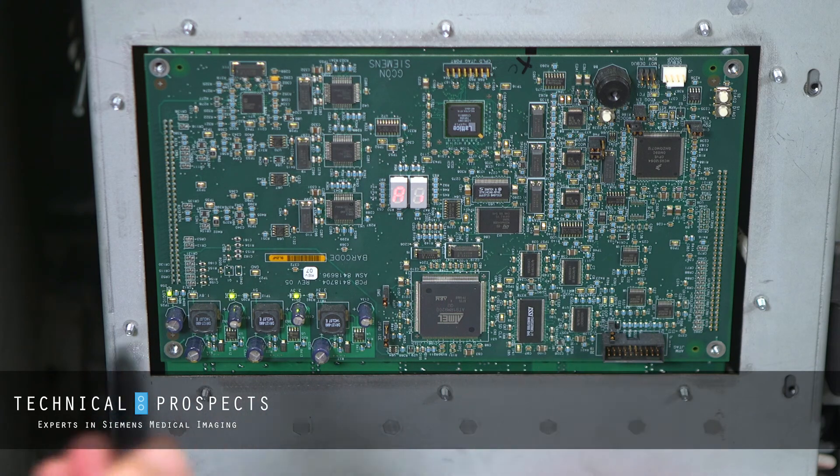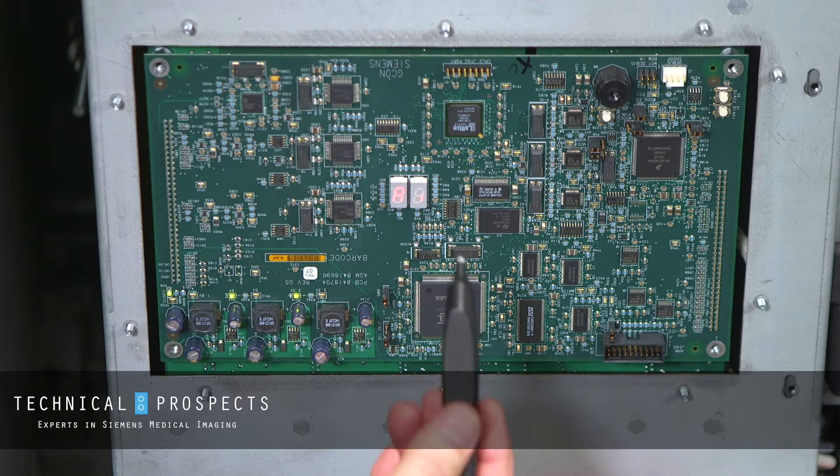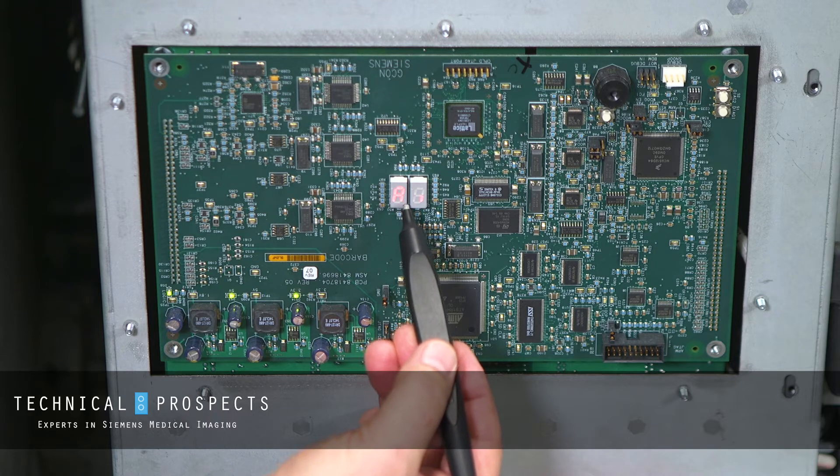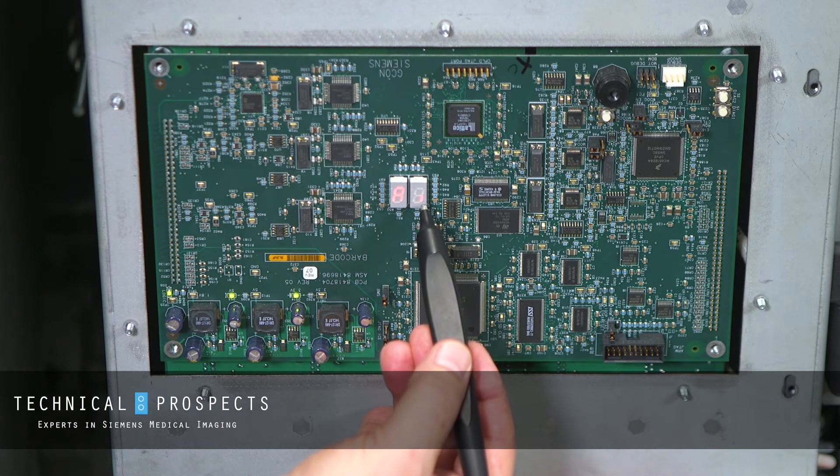This is the GCON board. It's located on the left side of the gantry once you remove the outside cover. On this board, in a normal status, the seven-segment display shows an A and a 1 — or an AI — whichever way you like to think of that.